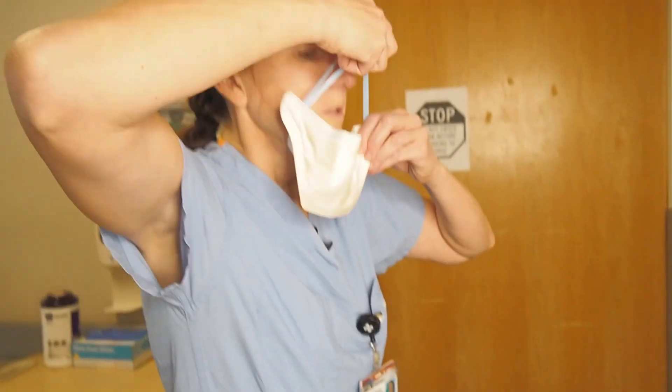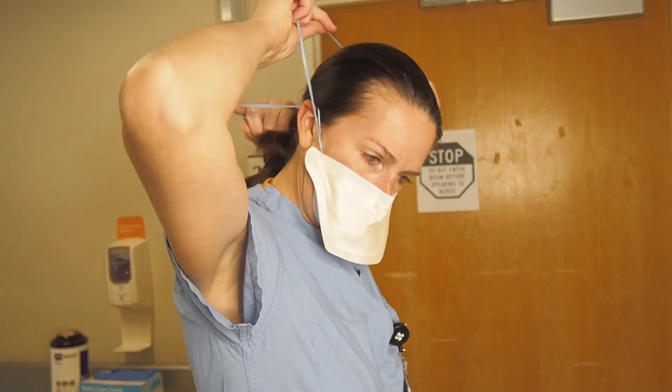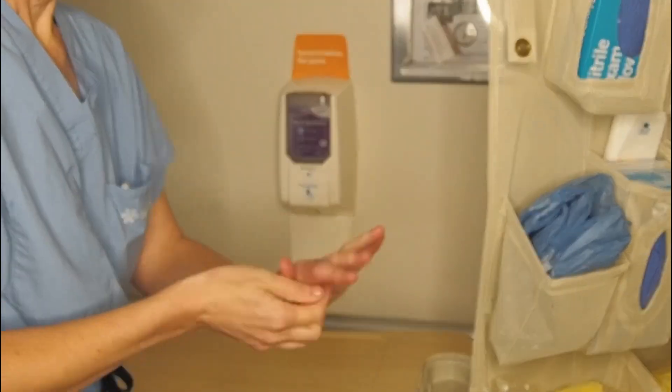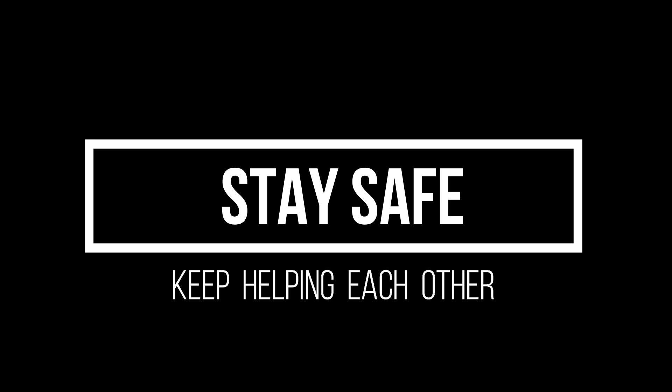Your respirator will be easier to put back on if you separate the elastic bands before placing them over your head. Then secure it to your nose and you're ready to go back to work. All patient encounters end with scrubbing out. That's it — stay safe out there, everyone, and keep helping each other.